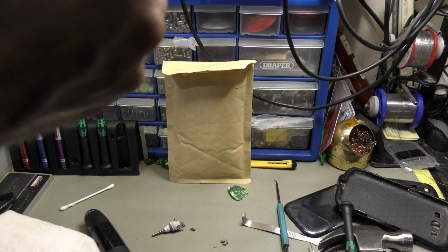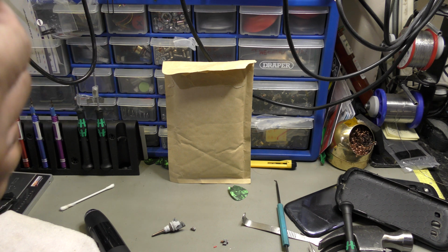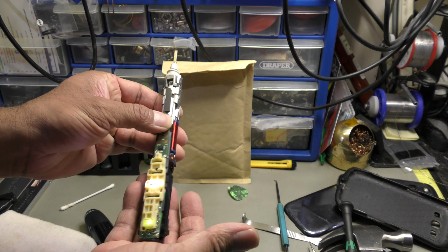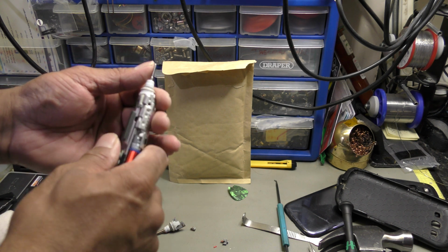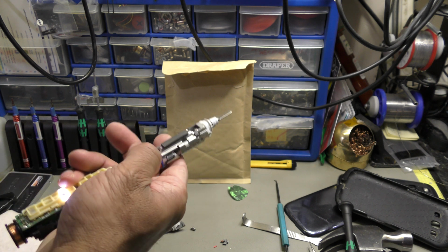So for that reason, I'm not going to mess around with dismantling it to try and create the space. There we go. It's working for me, you know. And when you're pressing on this, oh, so I'm quite happy with that.